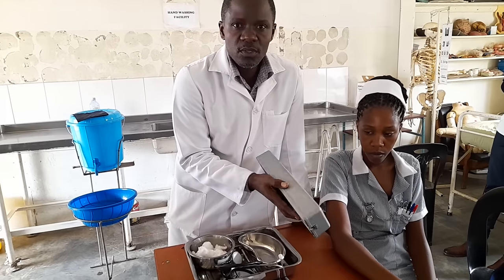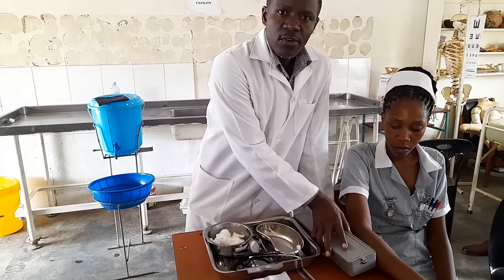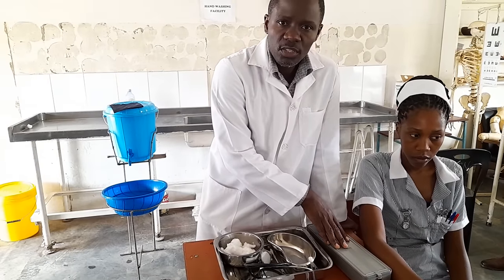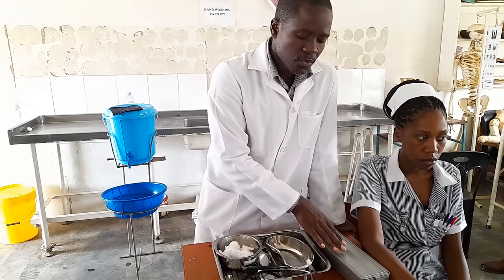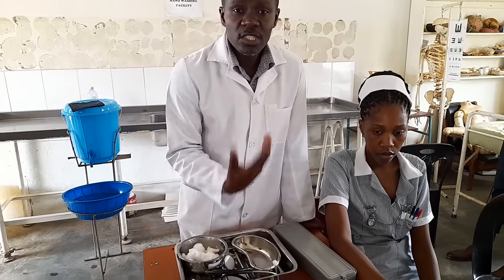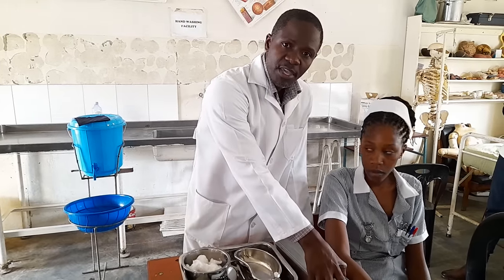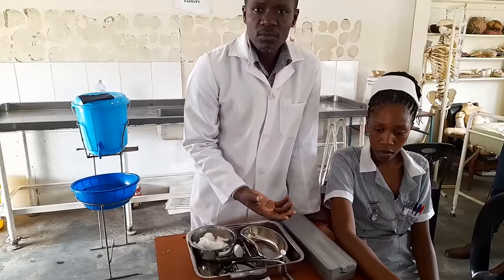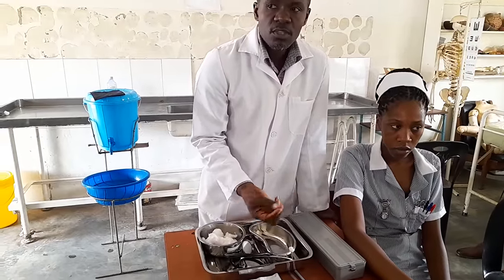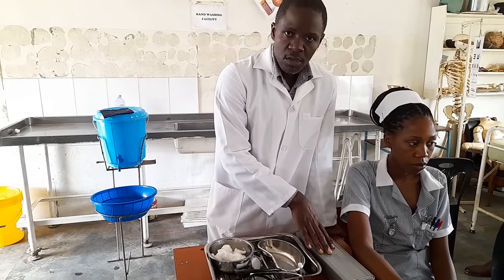There are many gadgets you can use to do BP. One of them is called a sphygmomanometer. This one uses mercury, so that's why it's a mercury sphygmomanometer. Then you've got an aneroid, which doesn't use mercury. Then you've also got digital, which just shows you the figures and does not use mercury. The common one we have around is a digital machine, but we also have the mercury. Mercury is usually there for students to use during OSCEs, where you'll be expected to use a sphyg that uses mercury or aneroid.